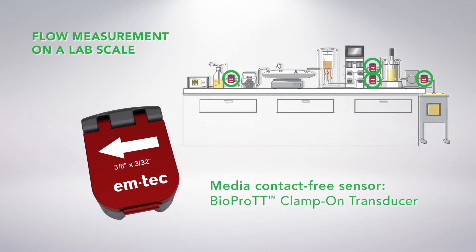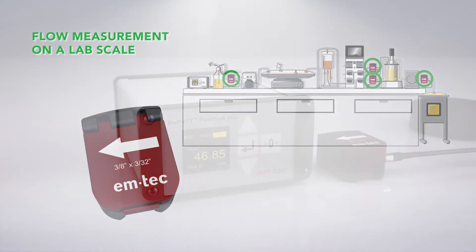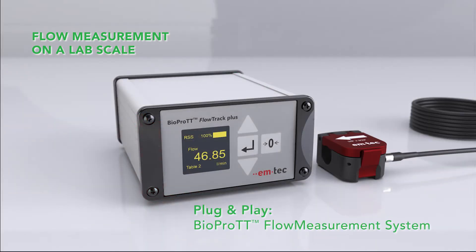Completing this system is the BioPro TT Clamp-On Transducer, which provides reliable flow measurement on flexible tubes thanks to a media contact-free and hygienic measuring principle. Utilizing the ultrasonic transit time method, this system meets the strict requirements of your flow measurement application.